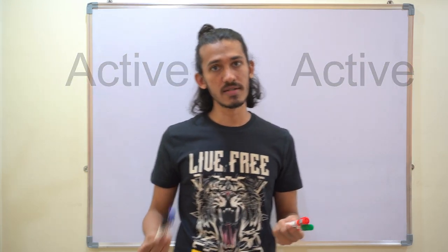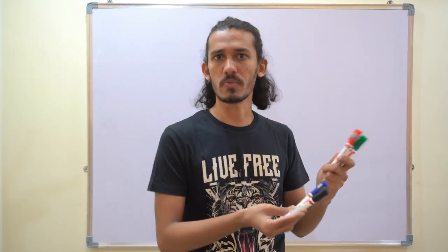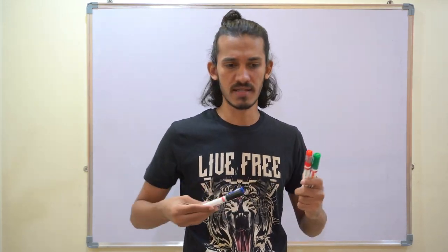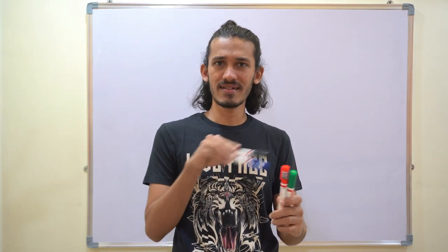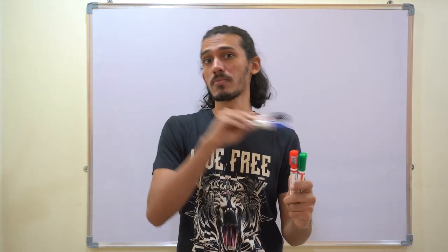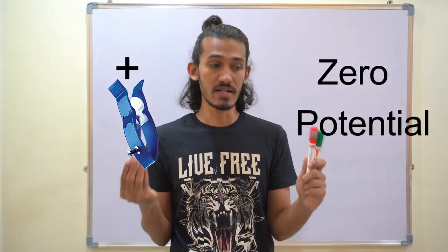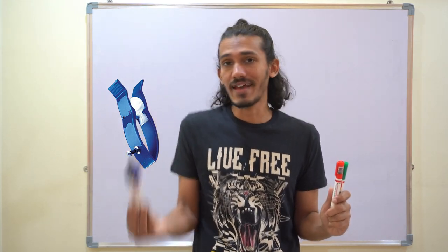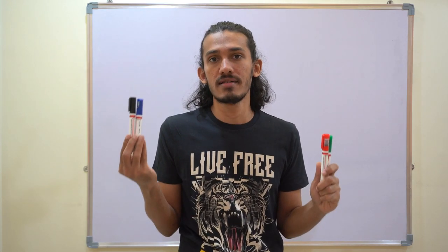The next scenario is using a unipolar lead. For a unipolar lead, we take only one active electrode, and we put another inactive electrode. How do you make it inactive? We try to create a zero potential over here. How do you do that? We pass the terminals through resistance. In this example, we use a 5000 ohm resistance, and based on that, we create a near zero potential. And you take another active electrode. So we take a positive active electrode, we keep a reference electrode over here, and the potential at the active electrode in reference to the inactive electrode is measured in a unipolar lead.